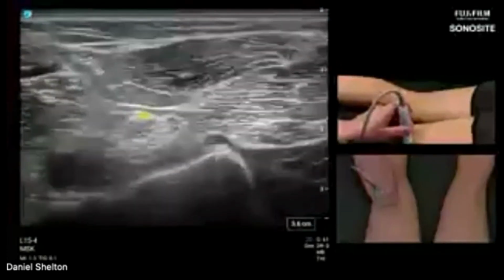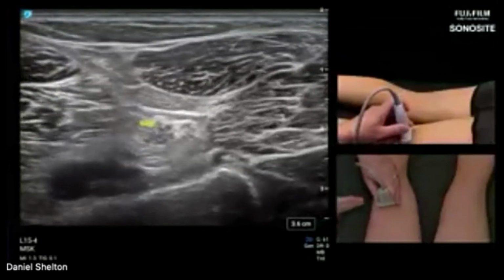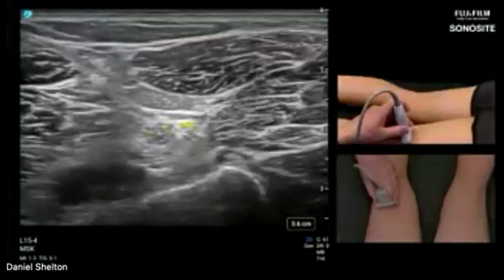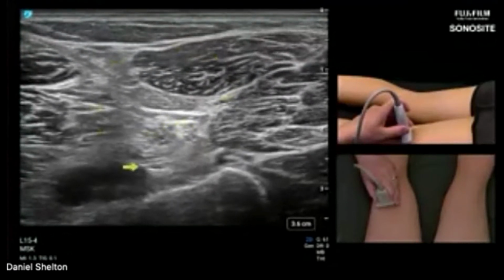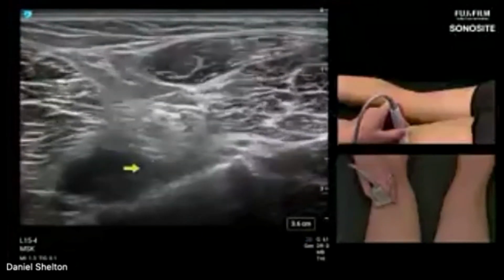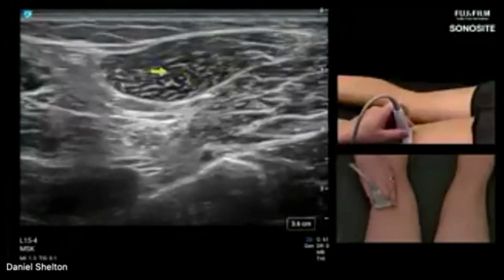And anytime you're scanning nerves, I tell people, take little 1-inch bites of the nerve. Don't just hold the image still, because a lot of times that'll make you get lost if the anatomy all looks the same. If you're in a morbidly obese patient or something, all the tissue can kind of be grainy because they don't have a lot of hypoechoic muscular architecture to enhance what's under it.